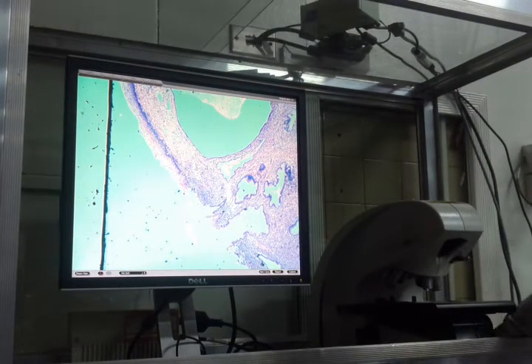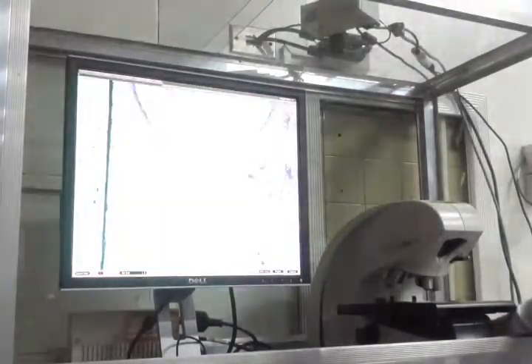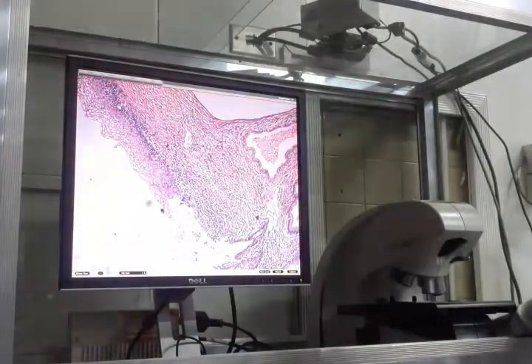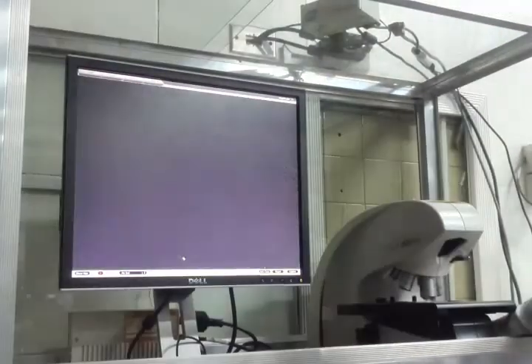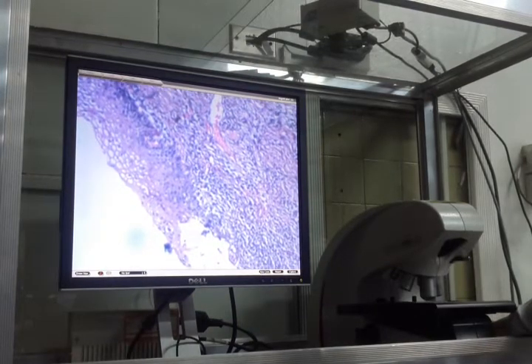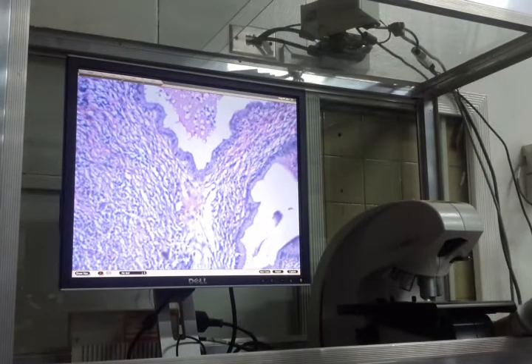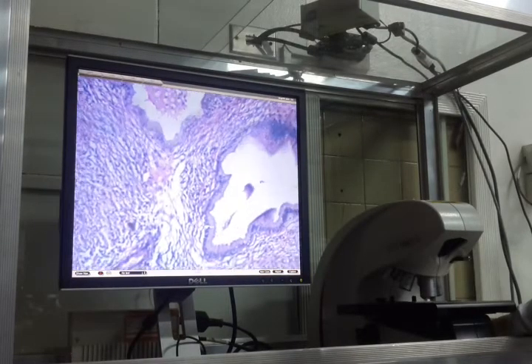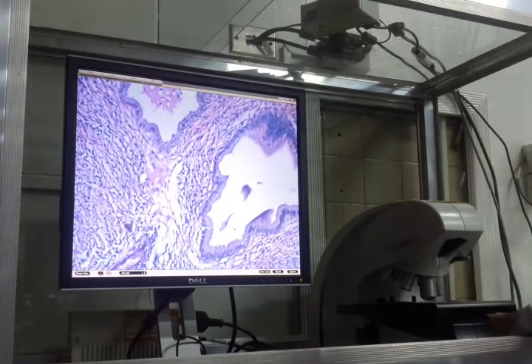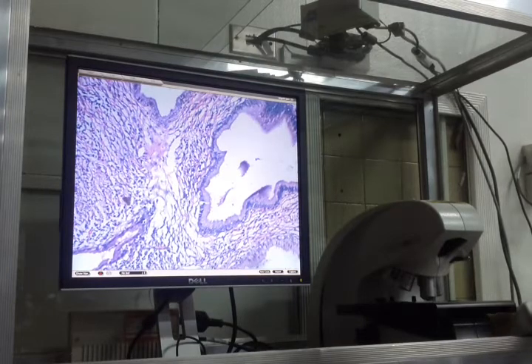You are in the squamo-columnar junction of the cervix uteri. Correct? The ectocervix, what you see here, is lined by stratified squamous epithelium, and the endocervix, where you see the endocervical glands or crypts, is lined by tall columnar cells with basally oriented nuclei.